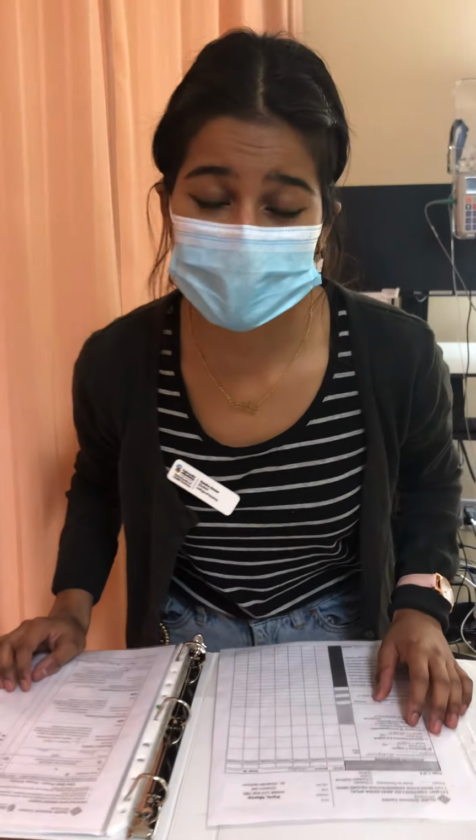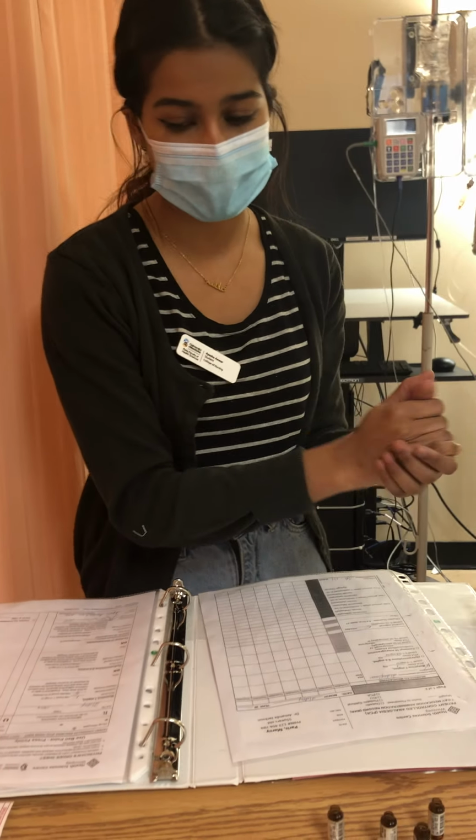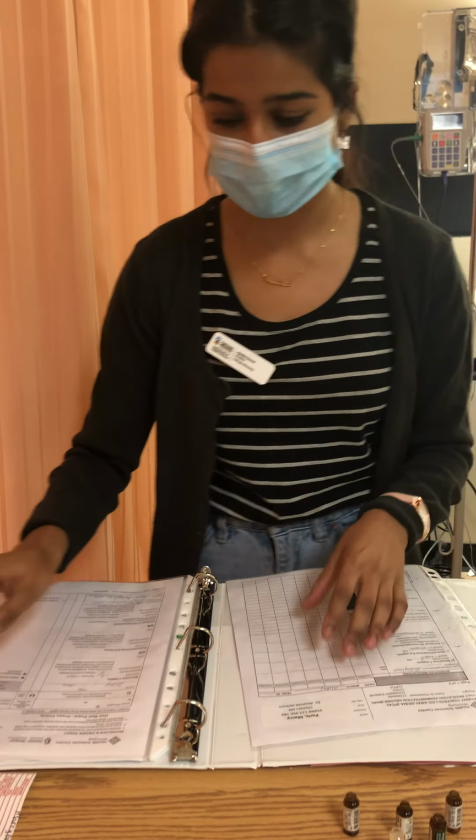Ayesha Anwar, and today I'm going to be doing a PCA bag change. Before we get started, I'm going to do my hand hygiene and review my physician's order and compare it with the MAR.